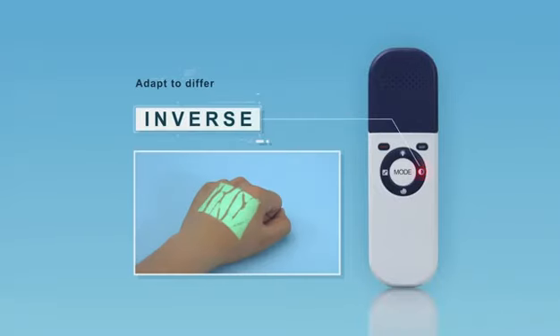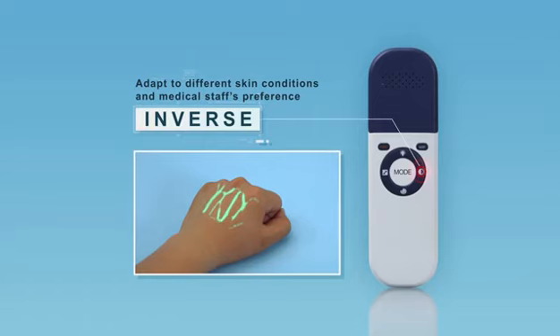Inverse mode helps device adapt to different skin conditions and medical staff's preferences. Short press the inverse button to inverse the image.